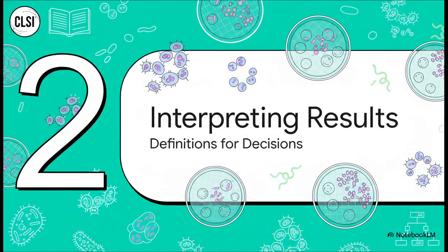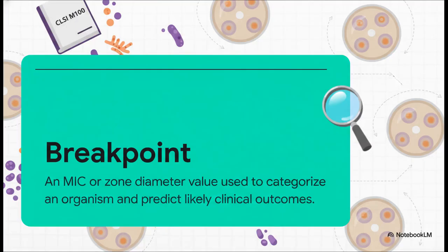Okay, tests are done. Now comes the interpretation. This is where the core definitions, breakpoints, and interpretive categories become absolutely essential for making the right clinical call. The breakpoint is the key number here. It's the specific MIC or zone diameter that sorts an organism into a category. And it's so important to remember, these aren't just arbitrary lab values. They're set because they are strong predictors of what's going to happen in the patient.